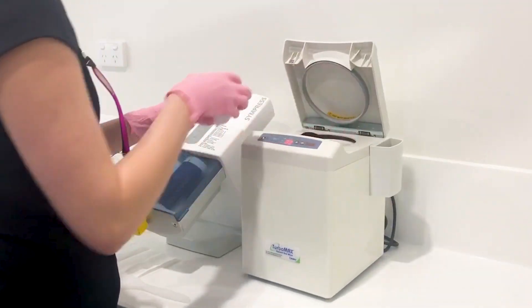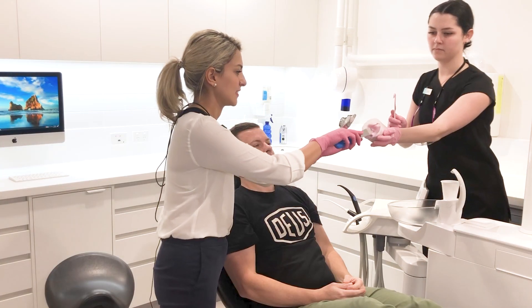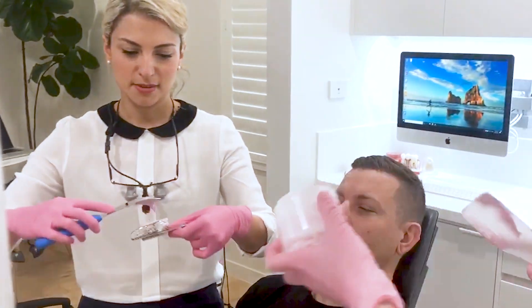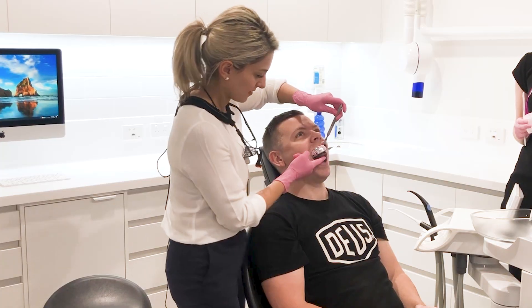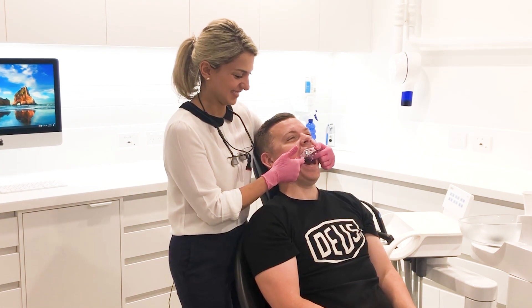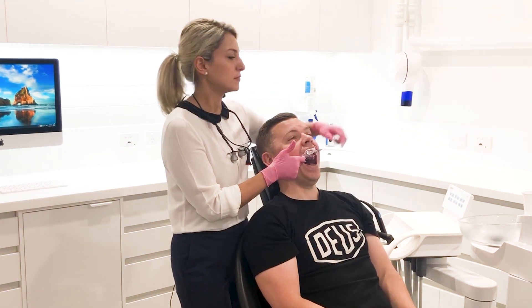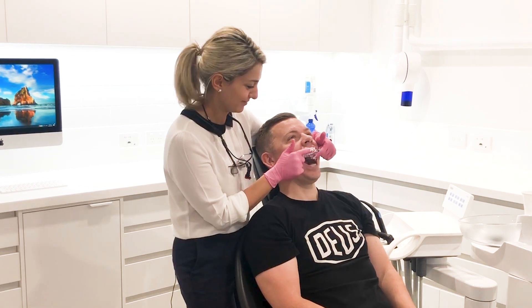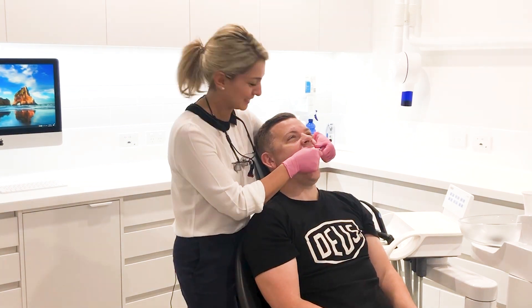To help you understand what that actually means, let me show you what a traditional impression is. What we do is we take a gooey type of material — usually it's alginate or PVS — and we put it inside a tray and then we squish it into your mouth. We then wait for four to six minutes, depending on the material, for it to actually set. This can be an uncomfortable four to six minutes — feels like a lifetime.